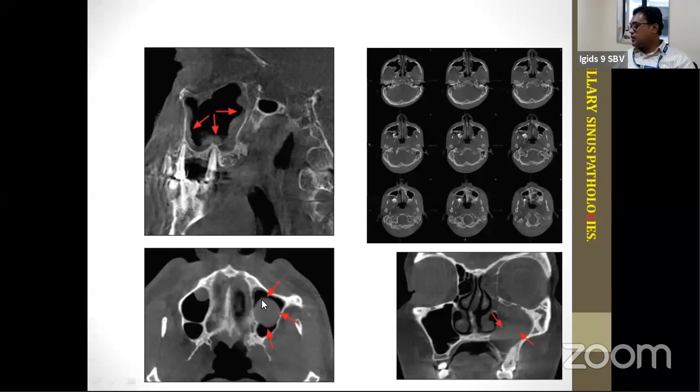column. Take a look at the coronal section here. The coronal section is revealing that the entire sinus is filled with haziness and radio-opacity, whereas on the other side, the sinus is perfectly radiolucent. So this is depicting a space occupying lesion within the maxilla. Likewise, in the axial sections, if you carefully run through these sections, take a look at this. As you go down the section, you are able to clearly see a polyp within the sinus, right? So these are the maxillary sinus.